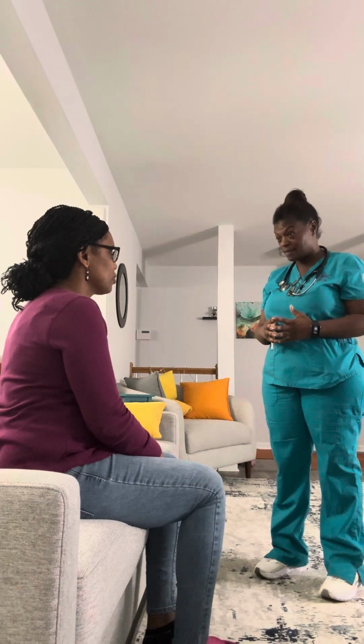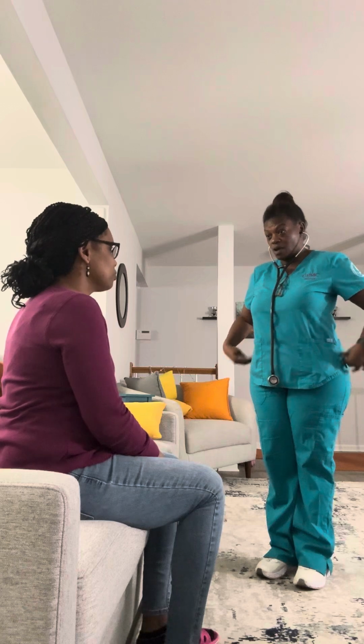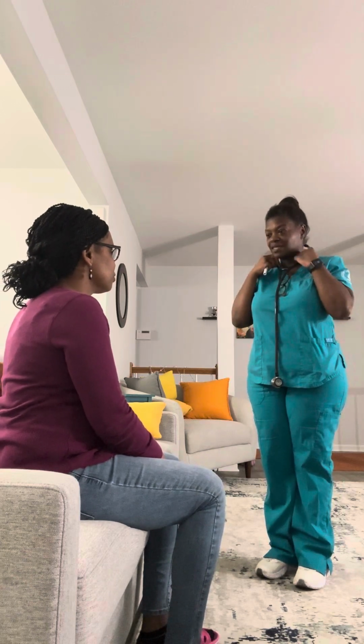So next what I am going to do is listen to your lungs. Will that be okay? Yes. Okay. First I will be listening to your lungs anterior, posterior, and laterally. I'm listening to your lung fields to see if they're clear and that I'm not hearing anything abnormal. What would be abnormal would be if I hear wheezing, and that would indicate asthma. Then I would have to document that and also let the provider know, okay? And if I hear any crackles or something like that, that would indicate some type of cardiac abnormalities, and I would also document that and let the provider know, okay?